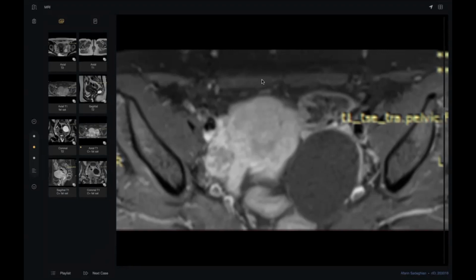Unmute yourself, doctor. Okay, this is serous cystadenoma. I will convey my finding to the referring physician and for the MDT of the gynecological team for discussion and management. Thank you, doctor, so much. Very tricky case. Very tricky.